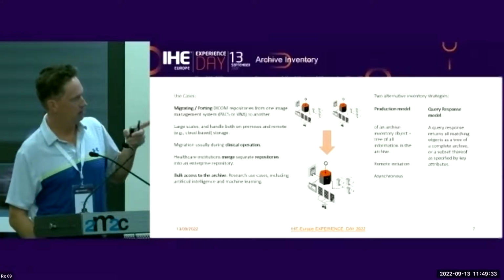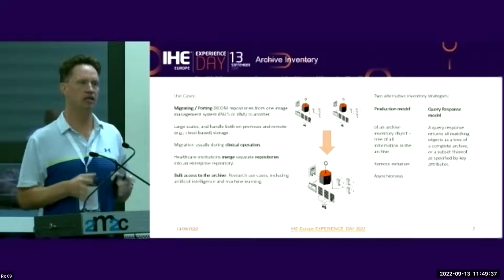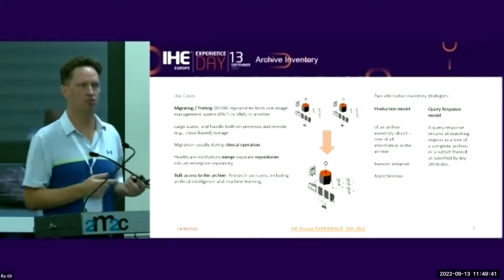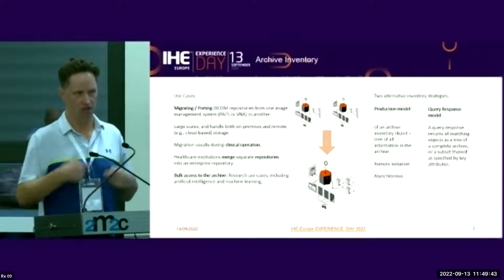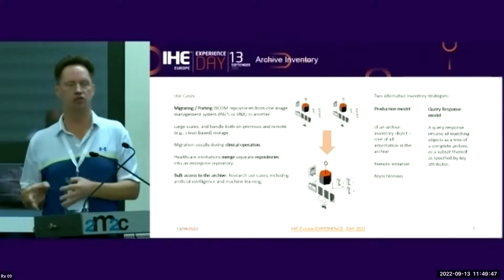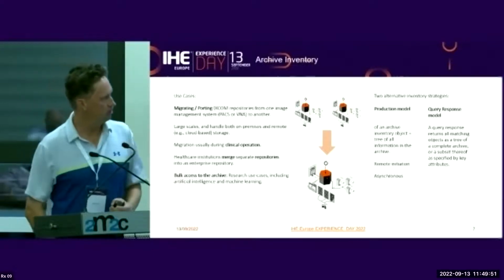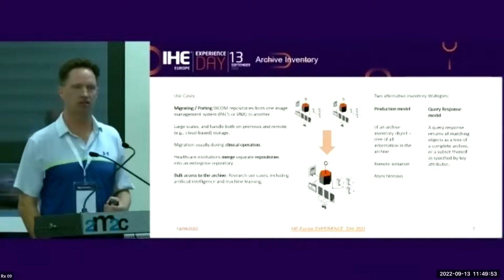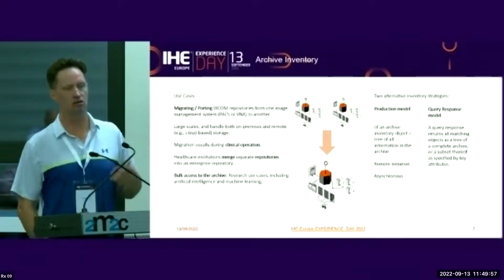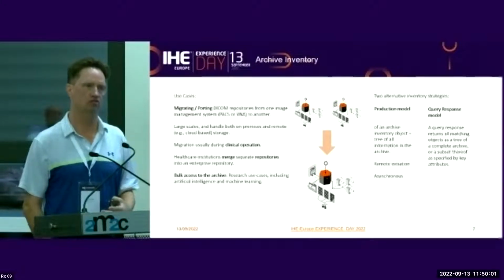And doing this on the side of normal clinical work is very, very important, because usually a PACS system can't be offline for porting. The hospital is still running, so you need to do it without using too many resources on the side. But some of the vendors complained within the standard that creating such a repository object is not the way that they do porting of archives.